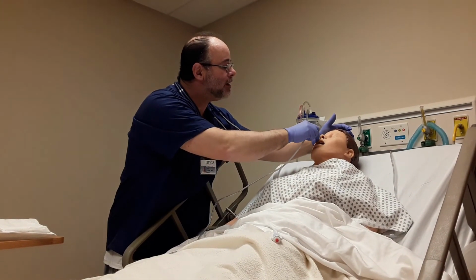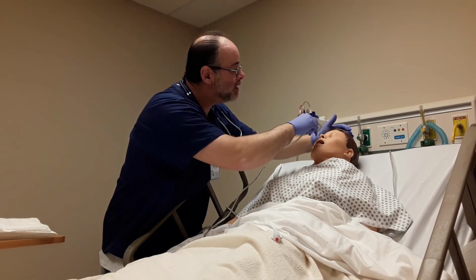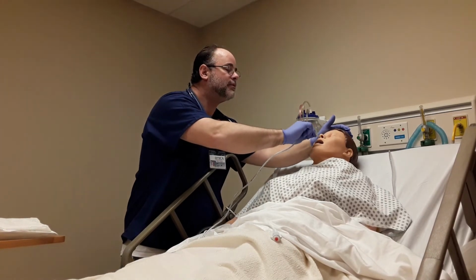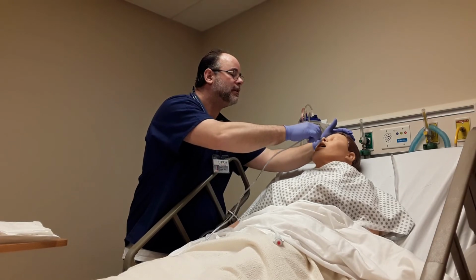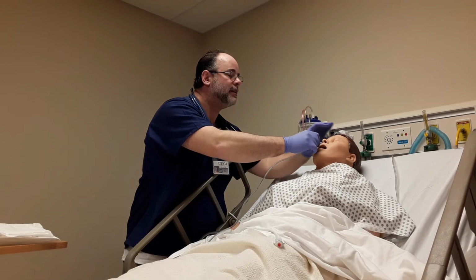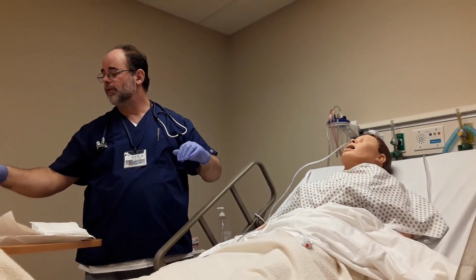Okay, begin swallowing now, sir. Okay, and as we're doing that, we're checking. We don't have any resistance going through. If you do have a little resistance, you can always twist the tube towards the opposite naris to help get through the passage, okay? And for purposes of demonstration, we'll say that we did get down to the 55, as the mannequin won't allow us to go any further.